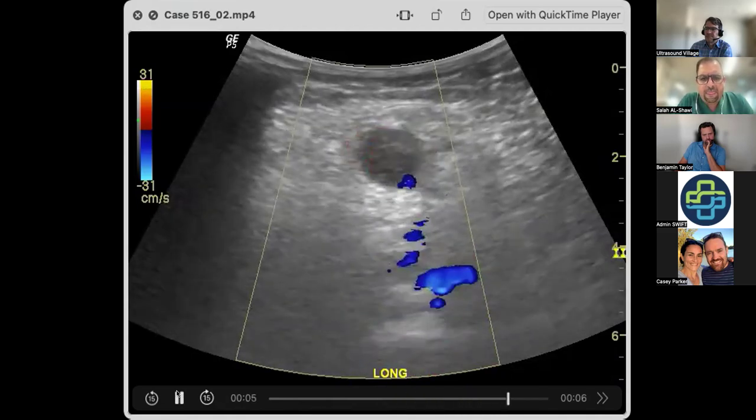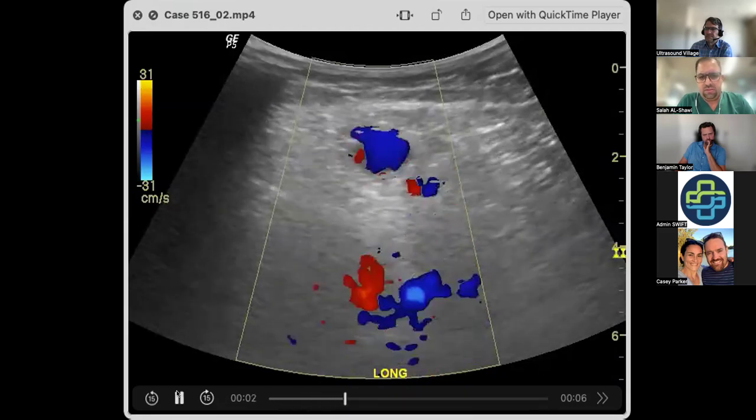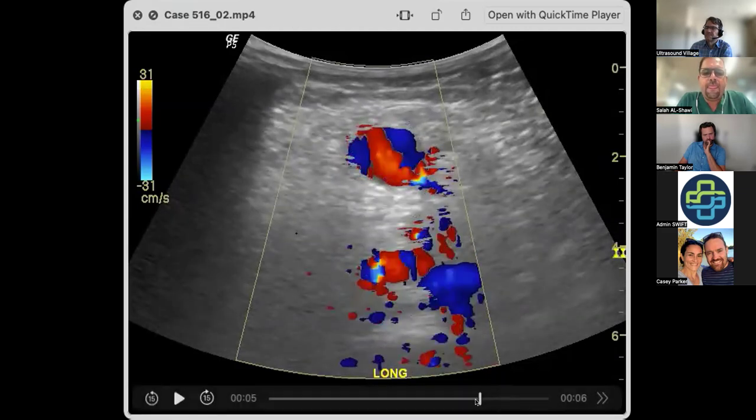It's a bit hard, Adrian, to say whether there is something on the side. I don't know, to be honest. I don't want to say something that is wrong. Okay, so it's a vascular structure, as you pointed out.